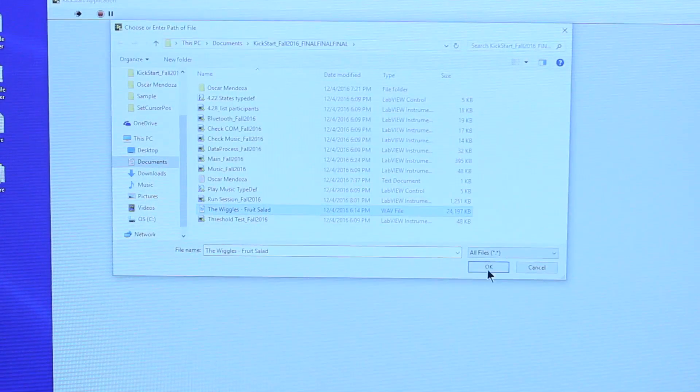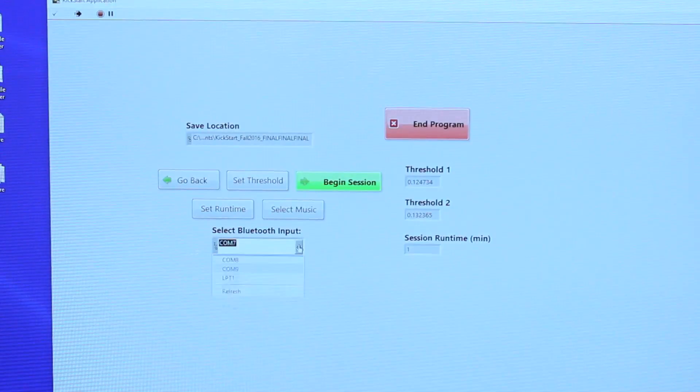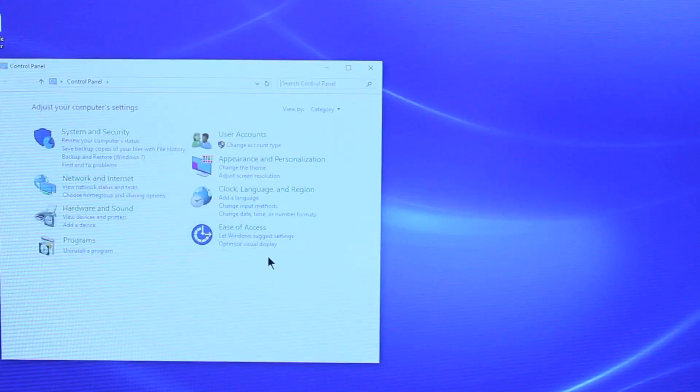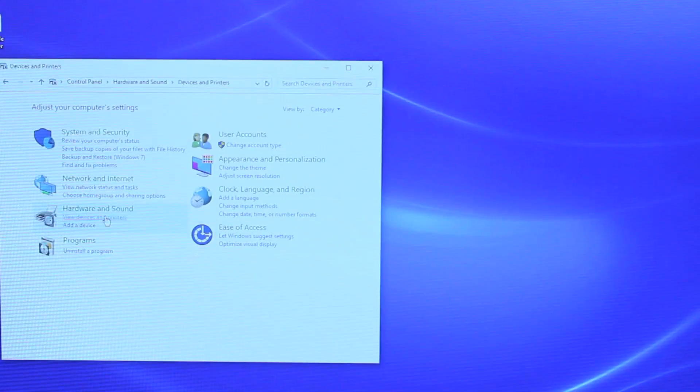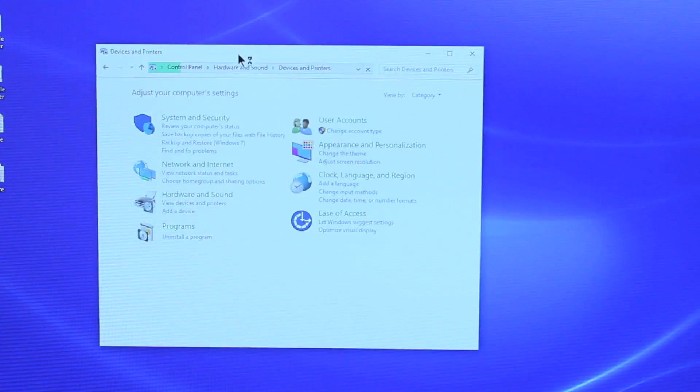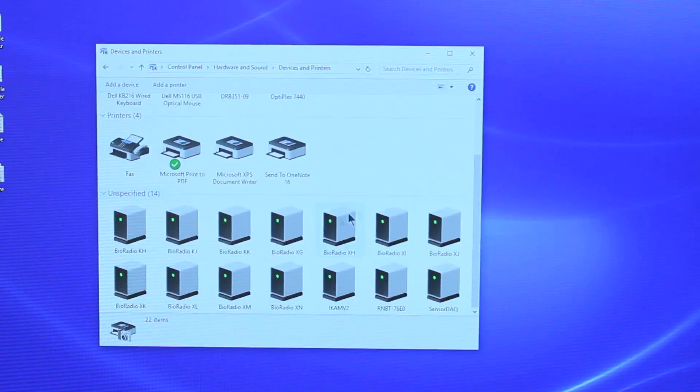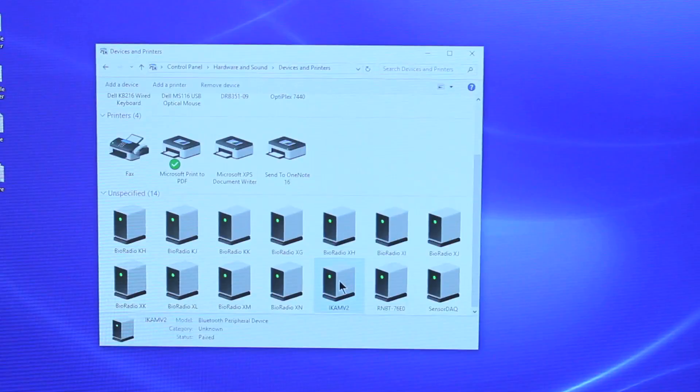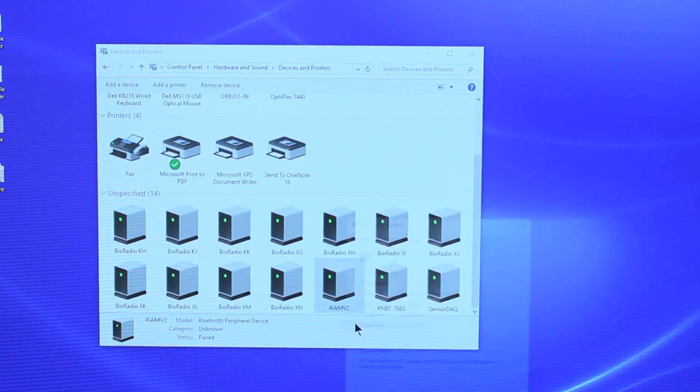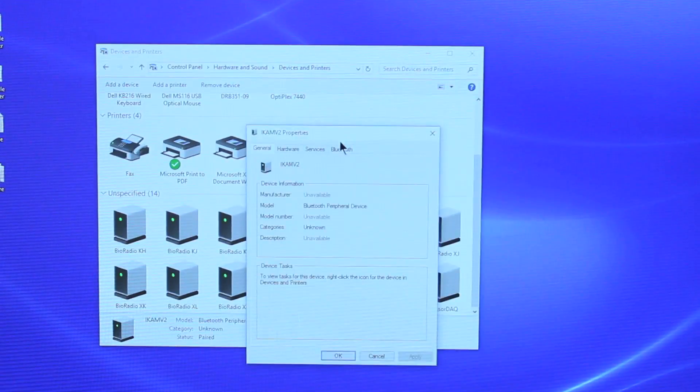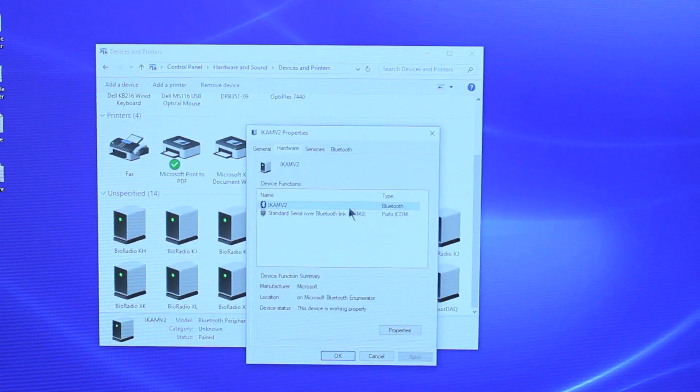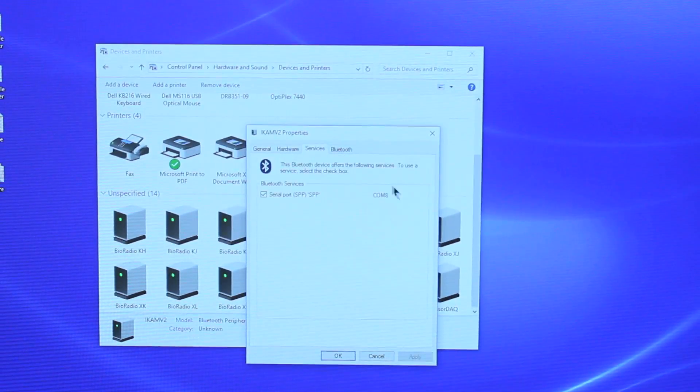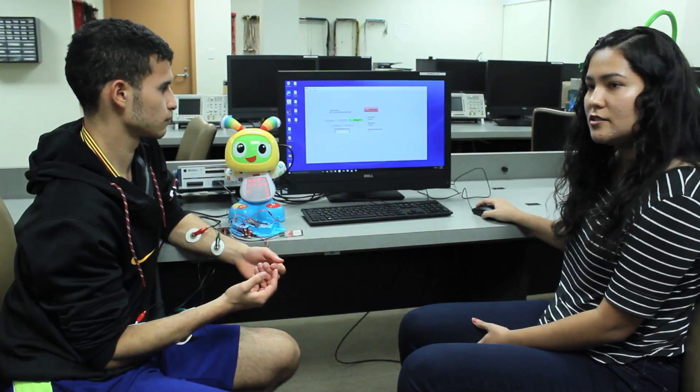Finally, you select the COM port that the device is connected to. To check the COM port, go to Control Panel and click on Devices and Printers. Scroll down to find your device, then right-click and select Properties. Navigate through the tabs to see which COM port your toy is connected to.